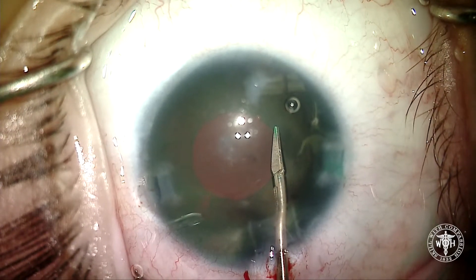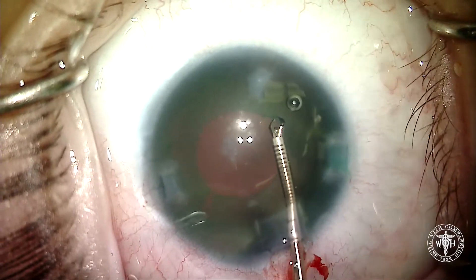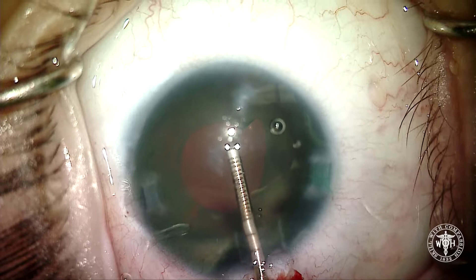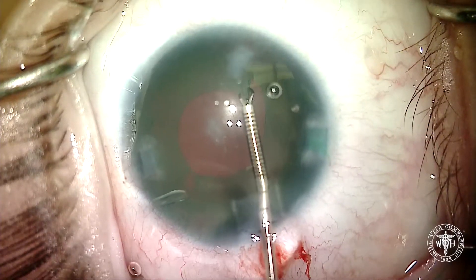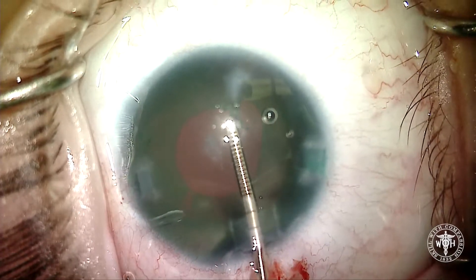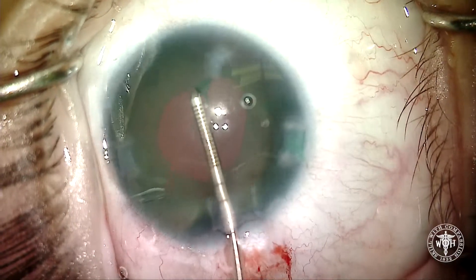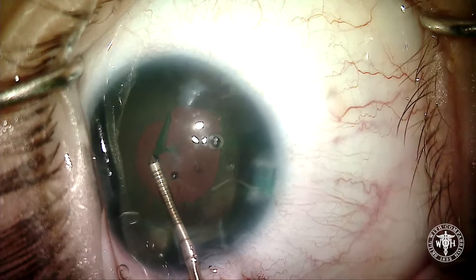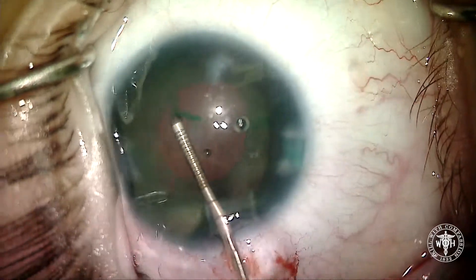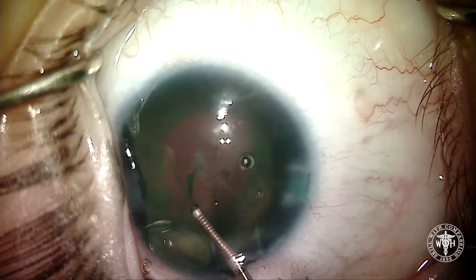To try and make it a bit easier for the artificial iris placement, I'm going to enlarge the capsulorrhexis. I had a lot of concern about doing this but figured I might as well give it a shot. We took a little intraocular scissor — the horizontal scissor, also by MST — just to start the rhexis, and then I'm just going to peel around another millimeter or so. I don't need to go all the way around, just enough to tuck that large artificial iris into the capsular bag. Very careful tearing here, making sure not to extend the rhexis out, and eventually we're successful.